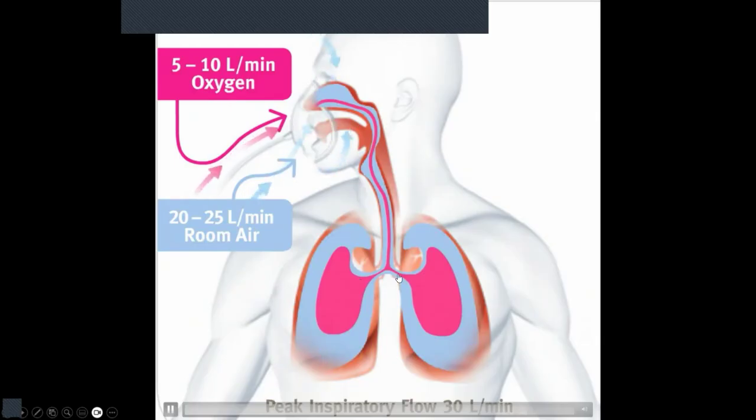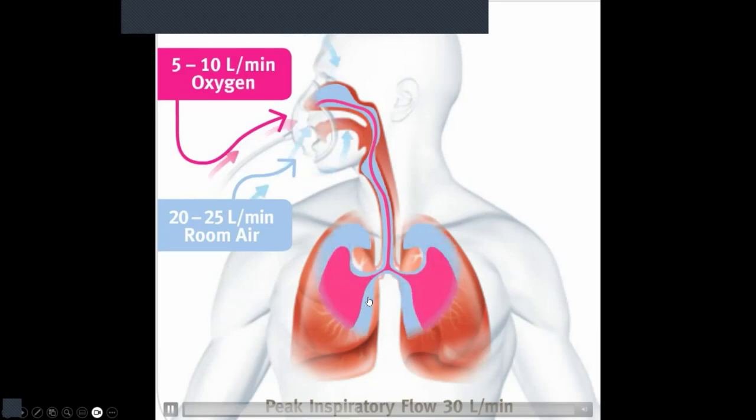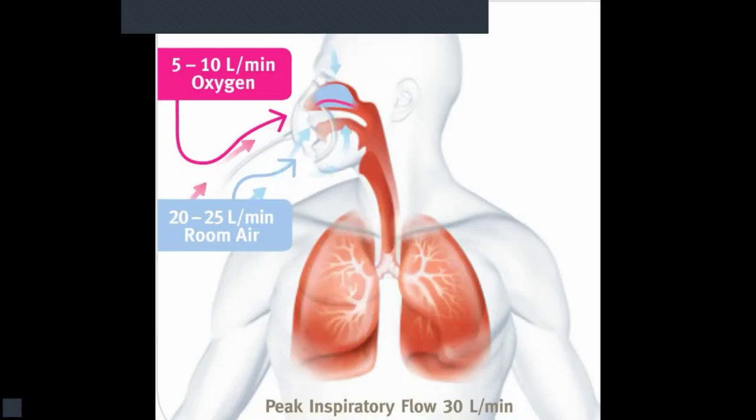See, there's a little bit of oxygenation going on there in the lungs, the pink area, but probably not enough to maintain adequate saturation levels. So if we were to monitor oxygen levels on this patient, we probably would find that they were a bit low.